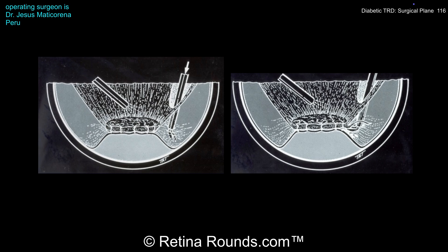The degree of segmentation versus delamination is up to the surgeon's discretion. While removing as much pre-retinal fibrosis as possible is preferred, this has to be weighed against the risk of creating an iatrogenic retinal break. Don't forget that the primary surgical goal is to relieve traction involving the macula.